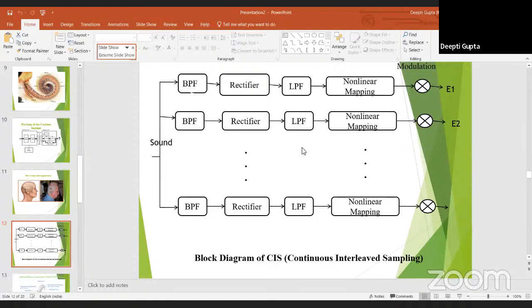It means like a normal person, if we get some sound of 4000 hertz, it will stimulate the hearing cells of 4000 hertz, but it will not stimulate the hearing cells beyond 4000 hertz. In a similar way, whatever frequencies we have assigned to the electrodes, it will go accordingly. If a sound is at 4000 hertz, it will go to electrode 12. I'm supposing, I'm just explaining to you. And according to the division, it will go to the electrode.